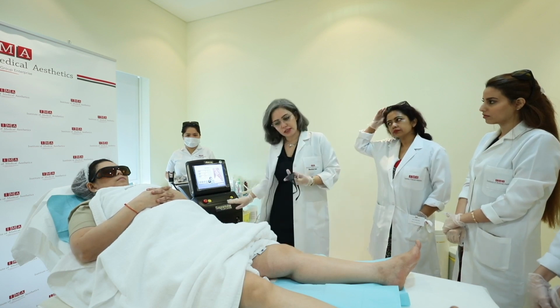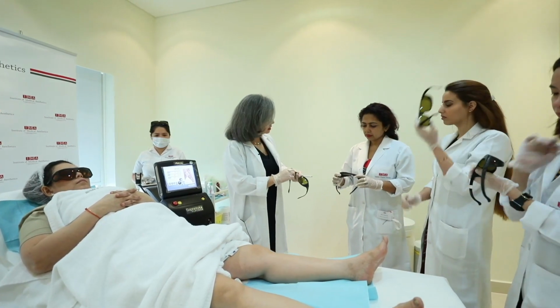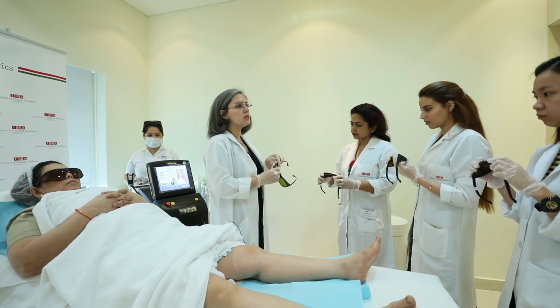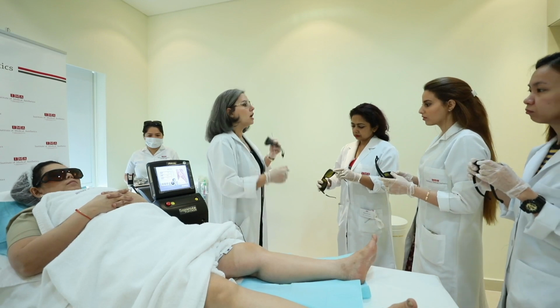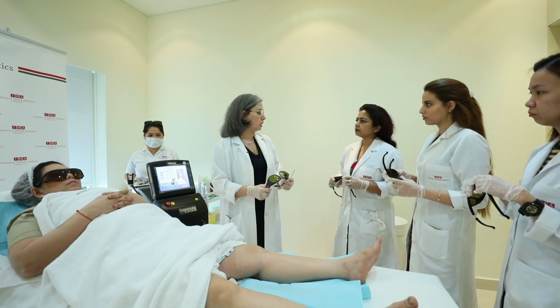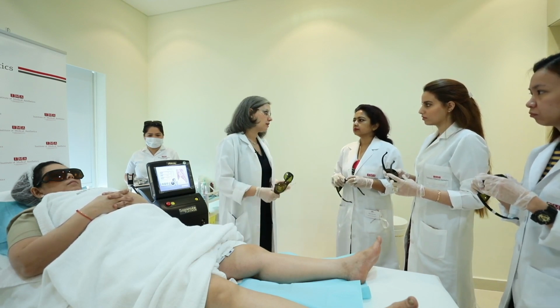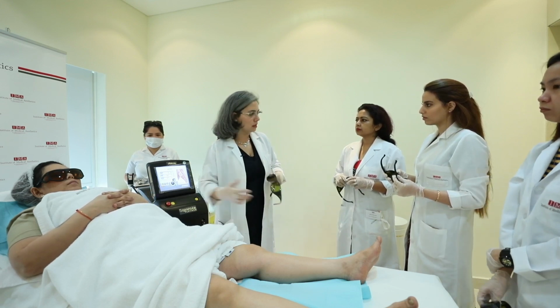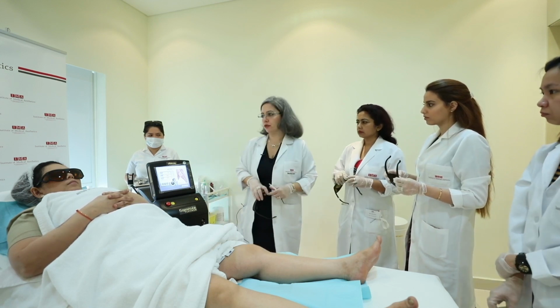It means the wavelengths that you are doing the treatment should be covered on the glasses. Usually the numbers are written over the glasses. Sometimes, like what I'm holding in my hand, it's written on the sides of the glass. Regardless of the brand of the glasses, the wavelength should be included in the range that you are protected with. You will, of course, hold your glasses, be ready, and give the patient the darkest optical density glasses. You wear something that lets you actually see what you are doing for the patient.